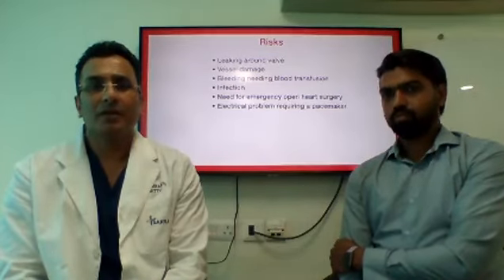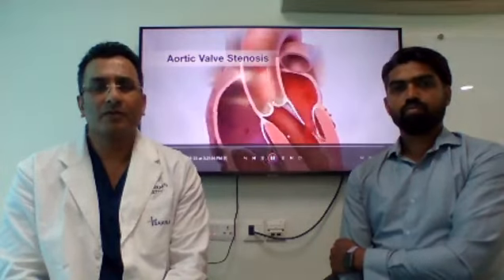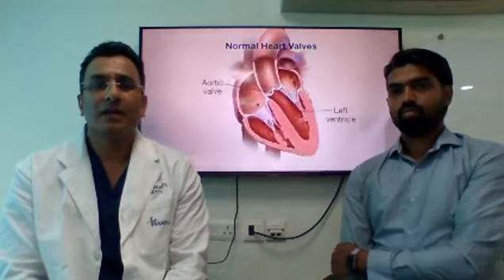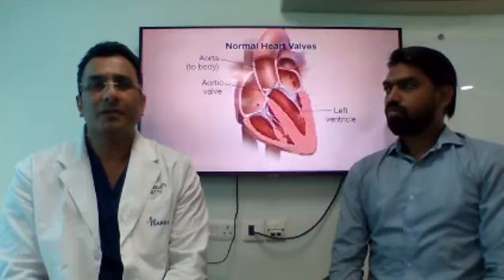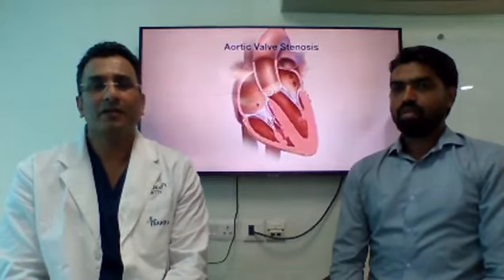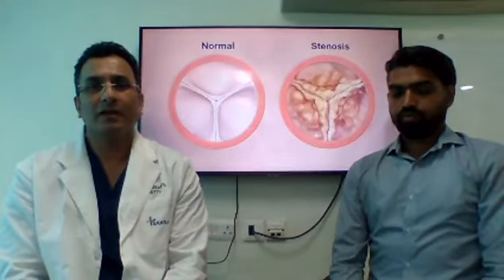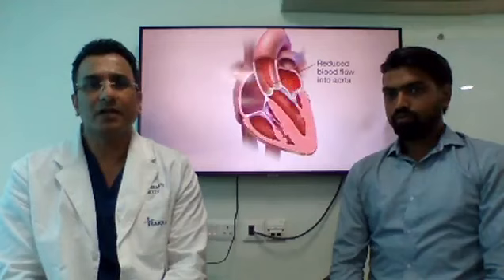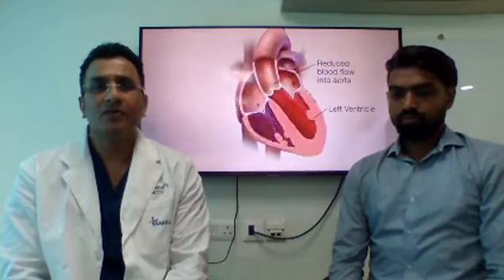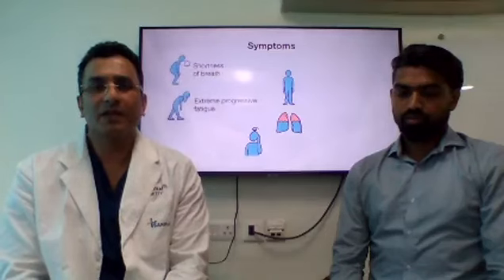Patient may develop electrical disturbance of the heart, particularly complete heart block, which may need a pacemaker. Rarely, cardiac perforation. Sometimes during implantation the valve may get displaced, and you may have to deploy it in another location in the aorta and take in one more valve. So these are the potential immediate complications of TAVI.